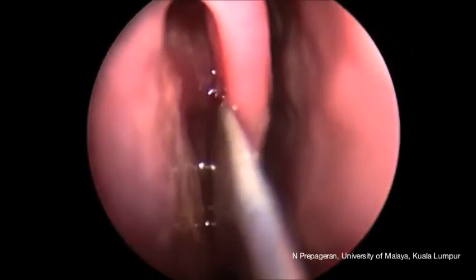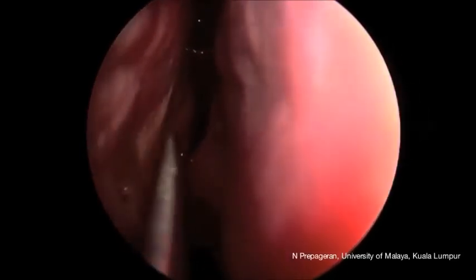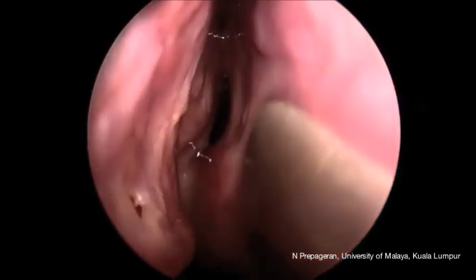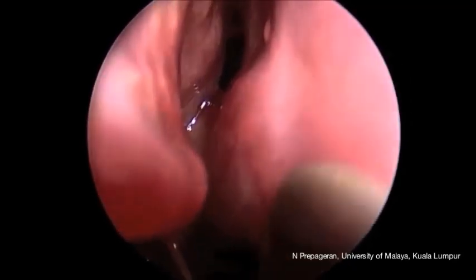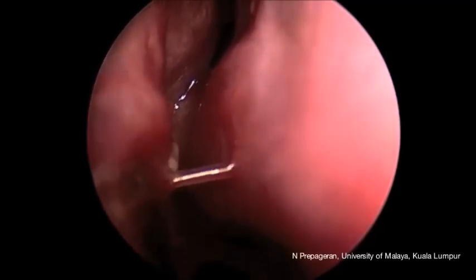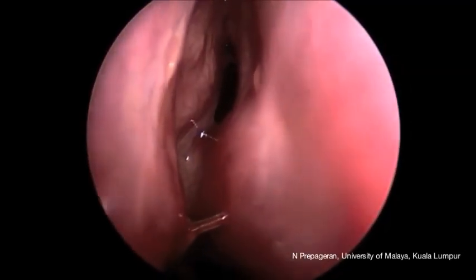This is the superior turbinate recess where the posterior ethmoid drains. And again, if you go medially to the superior turbinate, between the septum and the superior turbinate, you will go straight to the sphenoid ostia. So this is the place where we enlarge the ostia in a functional endoscopic sinus surgery so that the sphenoid sinuses drain very nicely.